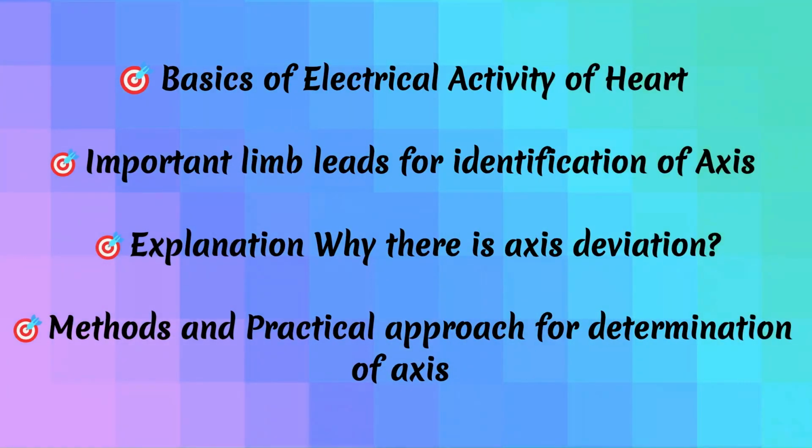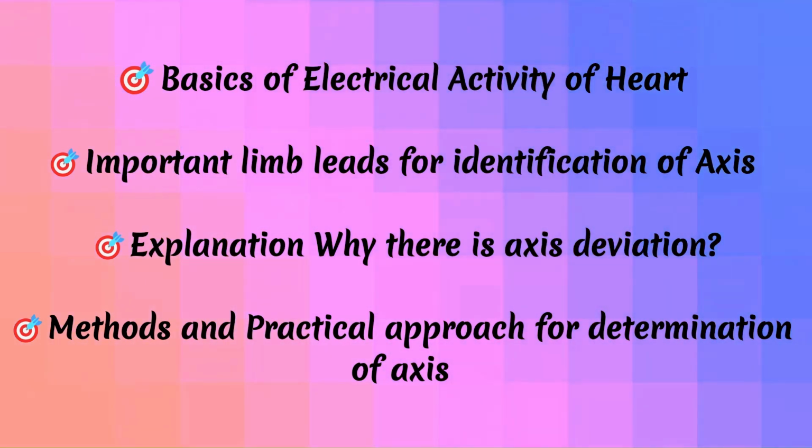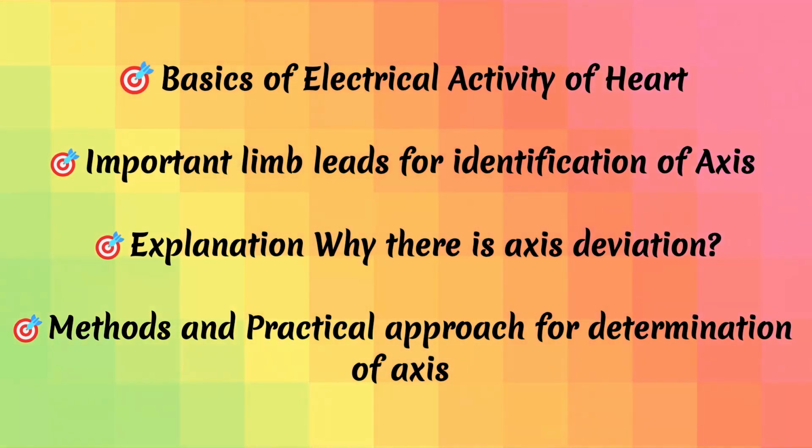In this video we will discuss basics of electrical activity of heart in brief. Important limb leads for identification of axis. Explanation of why there is axis deviation. Methods and practical approach for determination of axis.